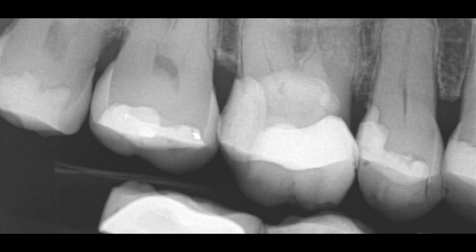Actually see a little bit of a lingual overhang that I'm going to let the patient know about. I usually send these videos to them. Appreciate watching them.